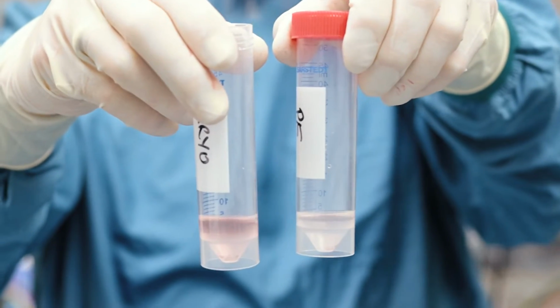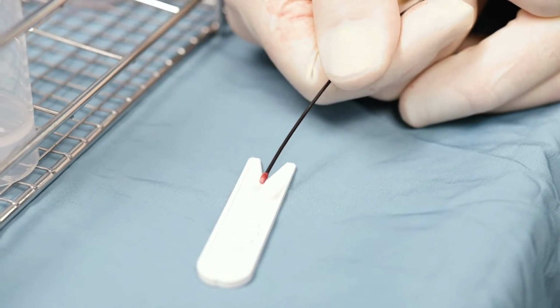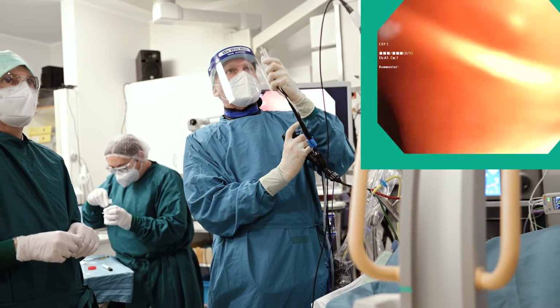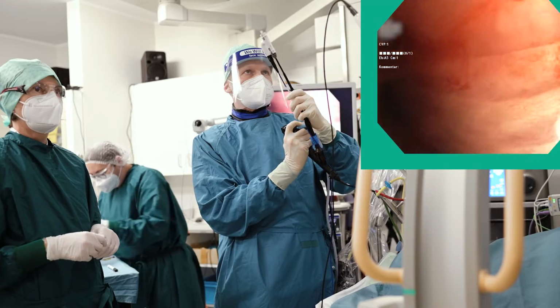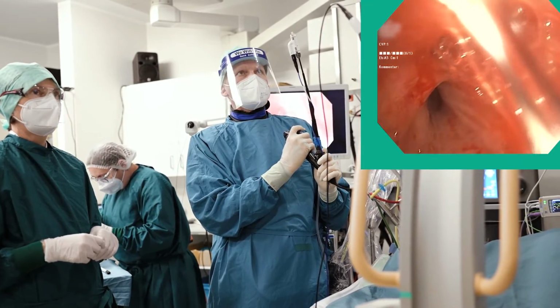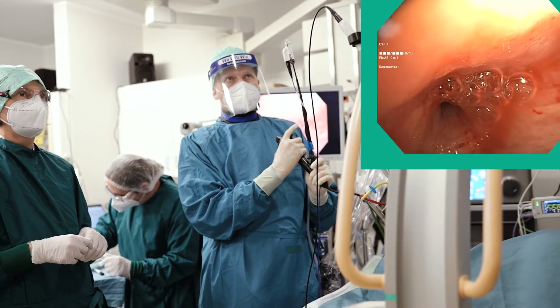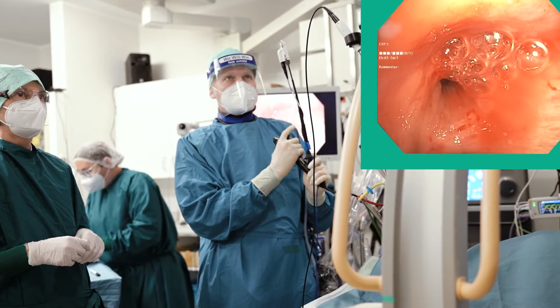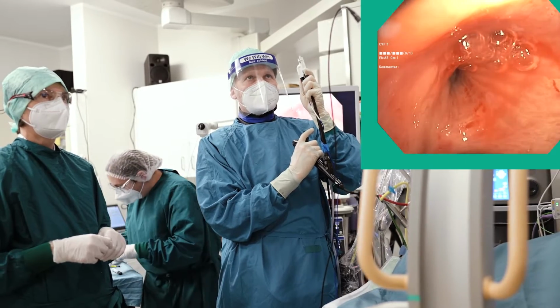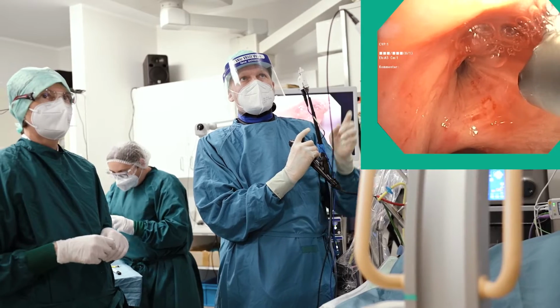With the help of the removal tool, the sample is gently removed from the tip of the cryoprobe. Forced removal attempts using forceps or sharp instruments should be avoided to preserve high quality for following examinations such as histology, immunohistochemistry, or molecular analysis. The conditions under which the sample is stored and transported should be defined as per institutional pathologist guidelines, taking into account the desired examinations. The bronchoscope is reinserted through the ET tube and advanced to the respective segment.